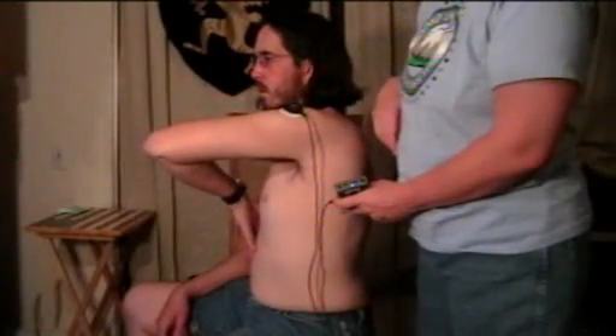Go back across your chest again. Turn your arm down to your belly and tighten your muscle across your chest. See there — we get a contraction. He's not doing it a lot because he's not fighting anything.